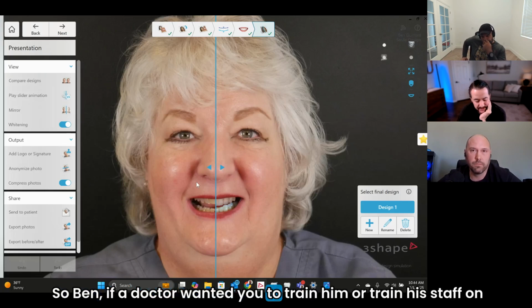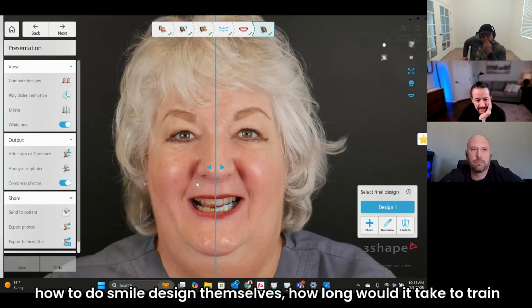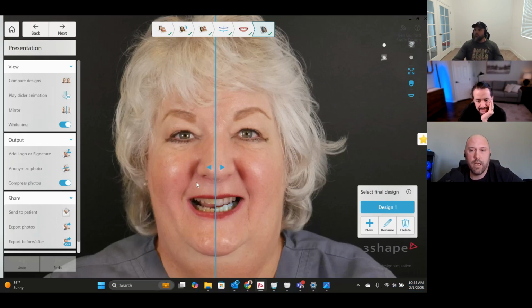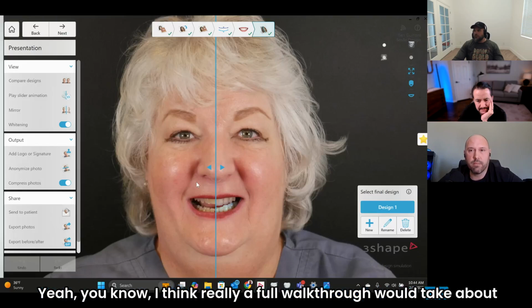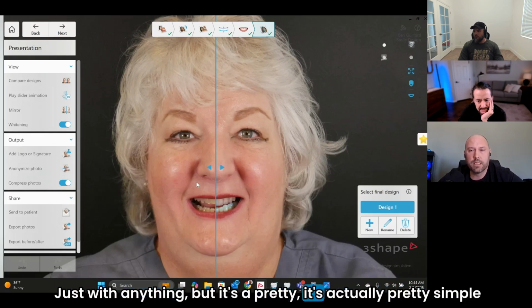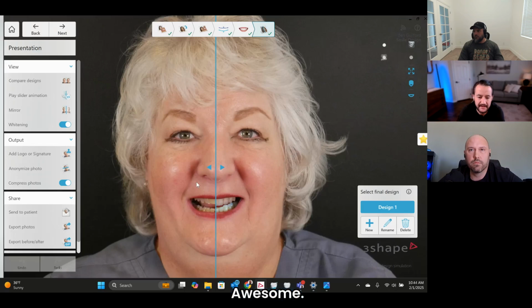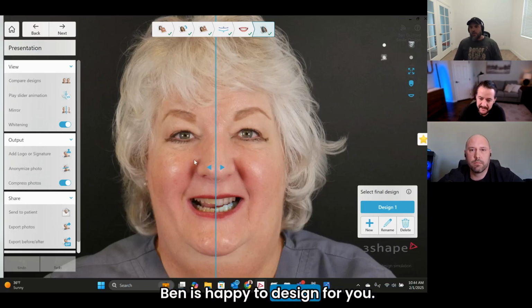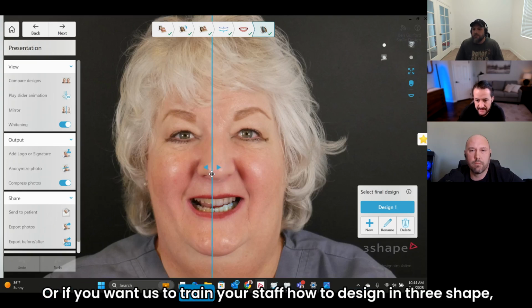If a doctor wanted you to train him or train his staff on how to do smile design themselves, how long would it take to train them how to get comfortable with the tools and do their own smile design? Yeah, I think really a full walkthrough would take about an hour. I think there's also going to be some follow-up on that, right? Just with anything, but it's actually pretty simple to get into. Awesome. So just so our doctors know, Ben is happy to design for you, or if you want us to train your staff how to design in 3Shape, we could do that too.